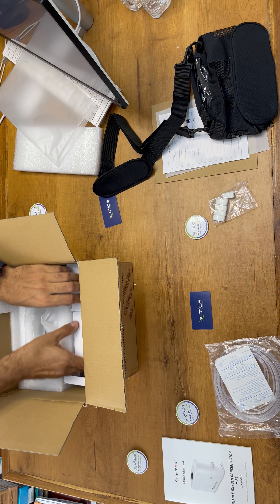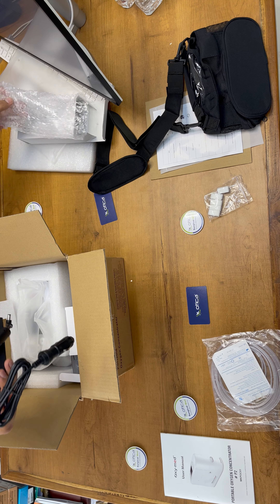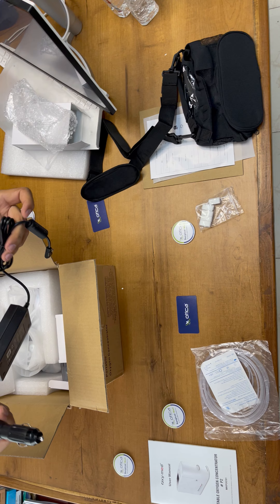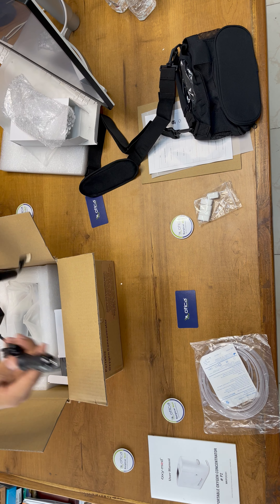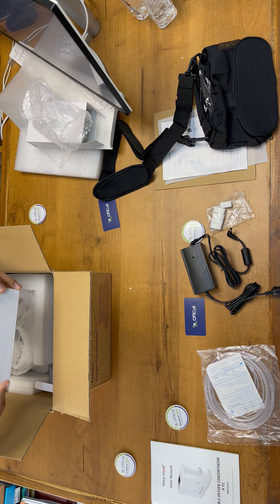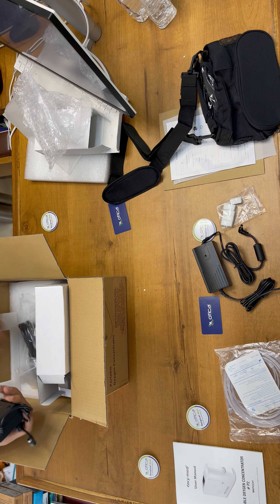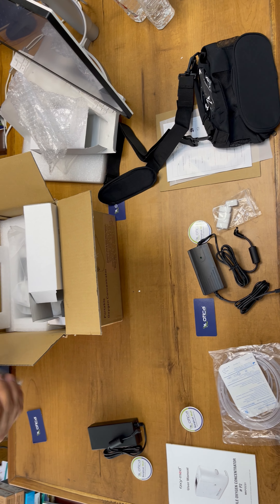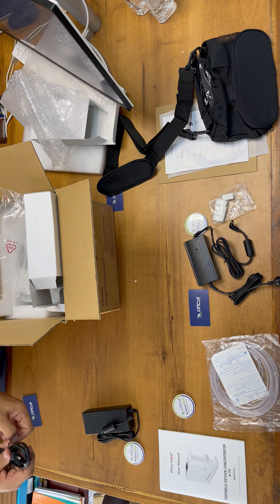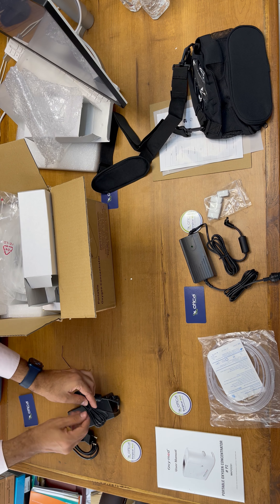Then we have this adapter — this is the DC charging adapter and it can work with a car, so along with this machine you can travel in a car and recharge the machine while using it simultaneously. They have also provided an AC charger which comes with the AC power cord, so you can recharge it at home. We are going to connect it and explain everything in depth so you will not have any further questions.